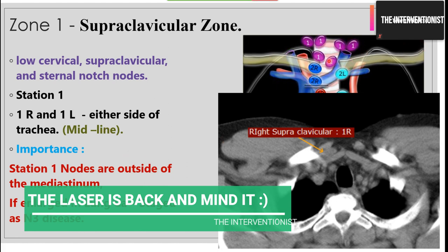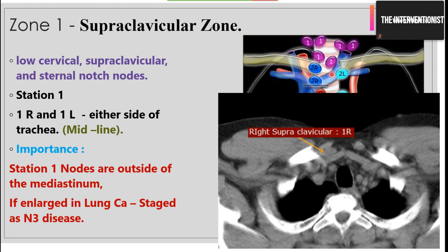The importance of the supraclavicular zone lymph nodes: if a lymph node is present in a case of either right or left-sided carcinoma of the lung, it is N3 stage. So station 1R and 1L with a lung mass is usually N3 status in TNM staging. This is an imaging representation of a right supraclavicular node, labeled as 1R since it is on the right side of the trachea.